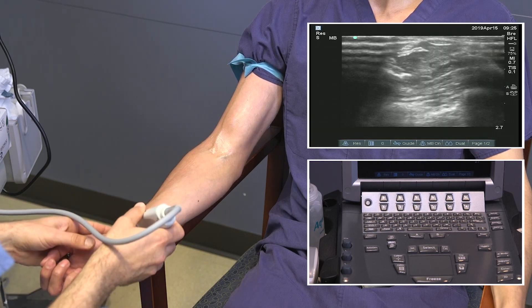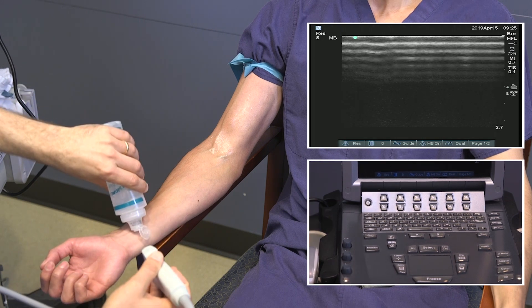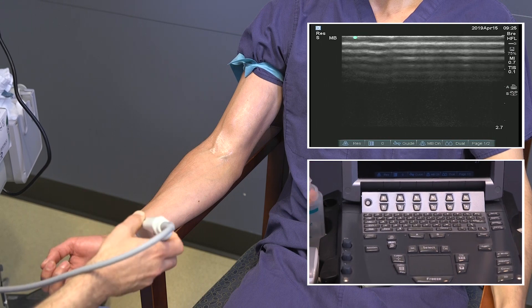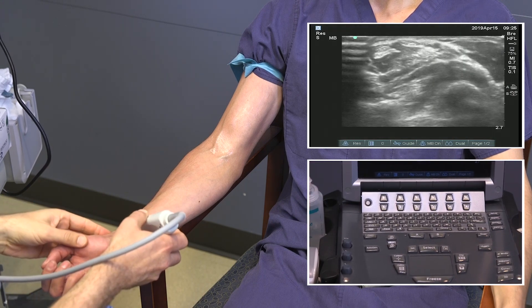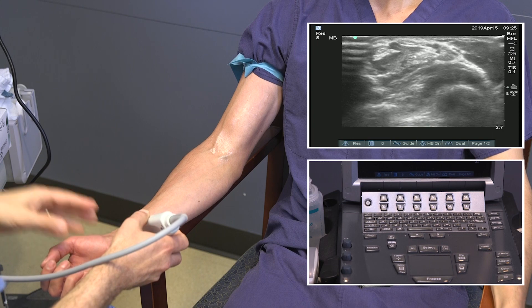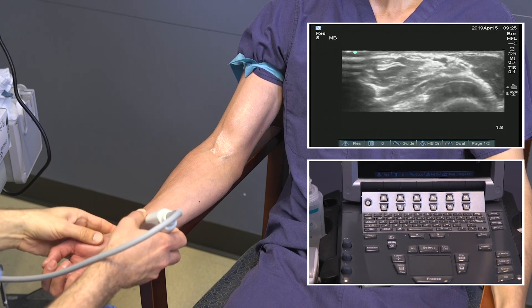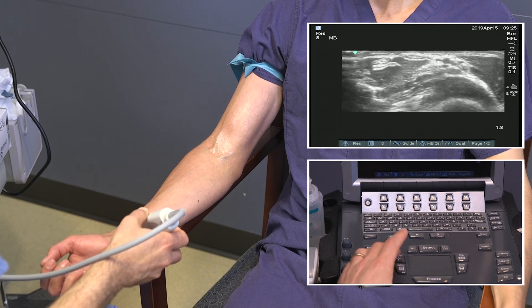Next, we want to think about potential access from below, so we want to look at the distal ulnar and radial vessels. In this case, we'll start with the ulnar side. At that depth, the vessels appear quite small, so to magnify, we change to a more superficial depth on the imaging.